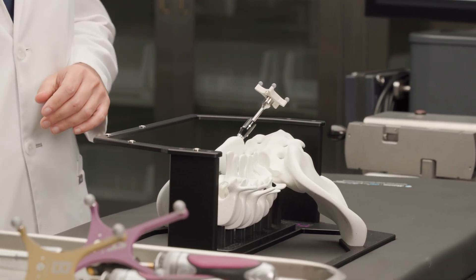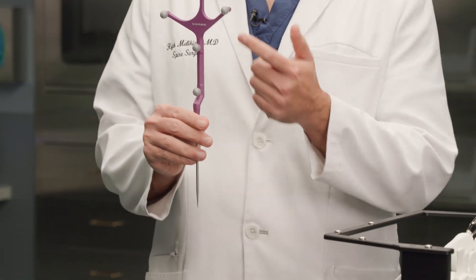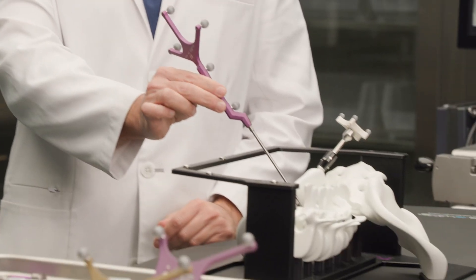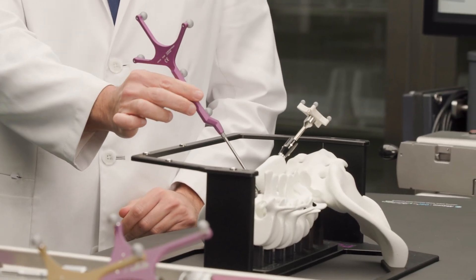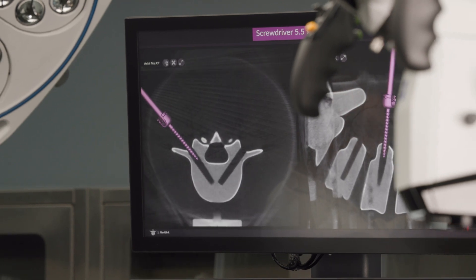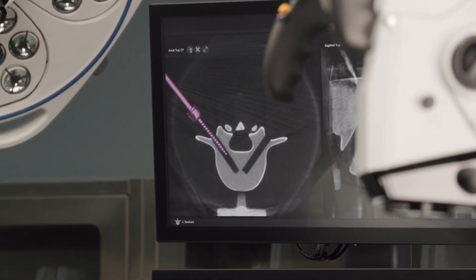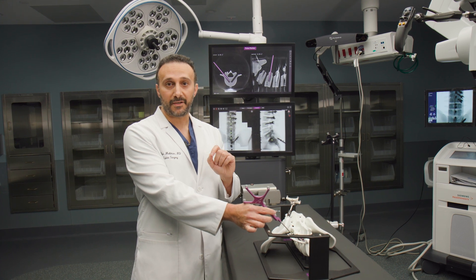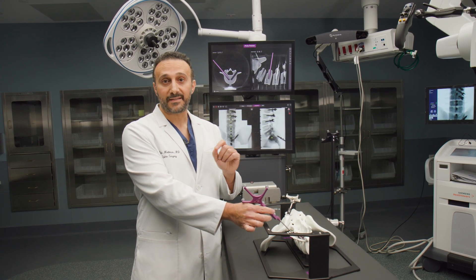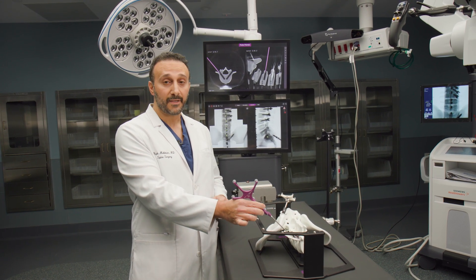What that allows us to do is we'll take some instruments that also have some reflective markers that are picked up by the camera, and that allows us to place it on the patient even before we've made an incision and to see exactly where in the spine we are going to be. This helps us with not only planning our incisions but choosing the appropriate size of the implants and all the other things that we need to take into account when we're doing surgery.